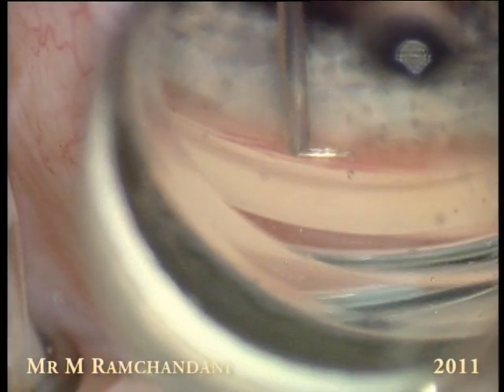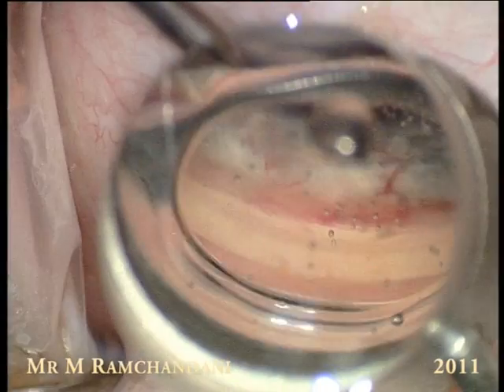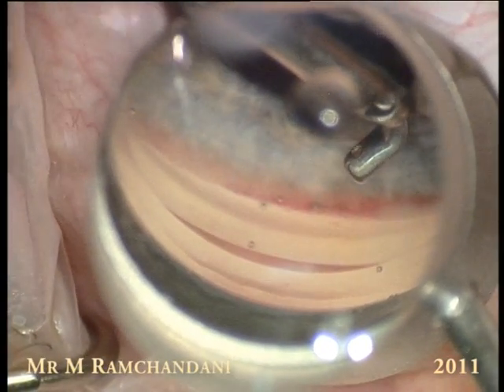In practice, inserting the stent in the right place demands more expertise than the earlier animation suggests. This is critical to the success of the device. Here we see the short end of the eye stent projecting into the front part of the eye. Once inserted, no other sutures or manipulation are required.